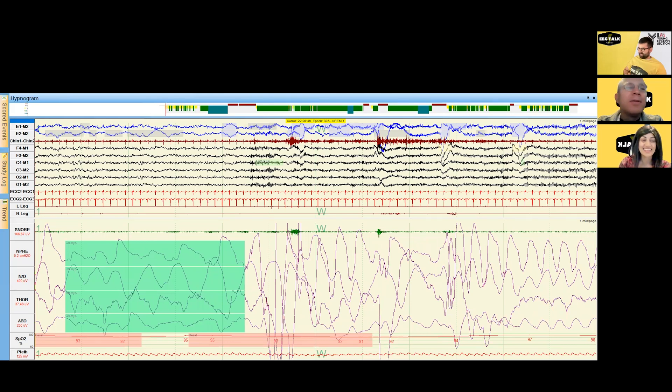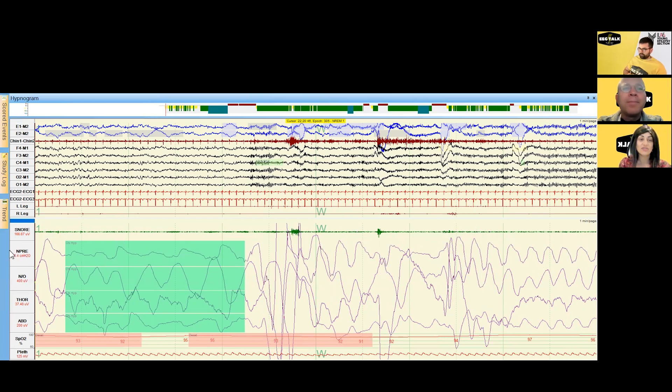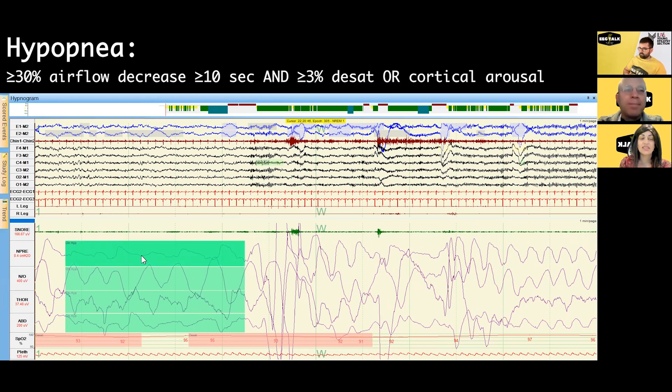There's something going on there. We establish a baseline level of airflow in the nasal pressure signal and look for a decrement compared to baseline. A 30% decrement in airflow is scored as a hypopnea, but you need an aftergoing physiologic consequence to fully score it. The event must be at least 10 seconds in duration with a 30% decrement in flow, and then there must be either a 3% oxygen desaturation or a cortical arousal — here we see both: a 4% oxygen desaturation and a cortical arousal.